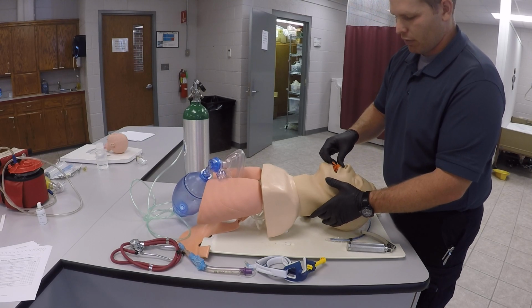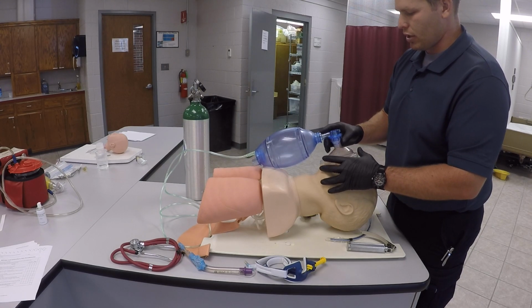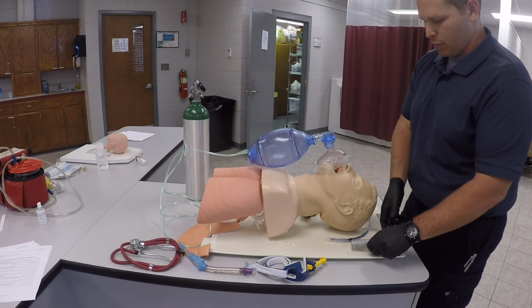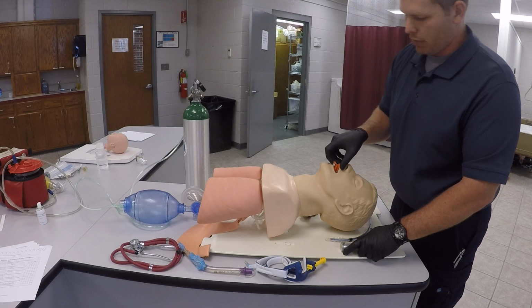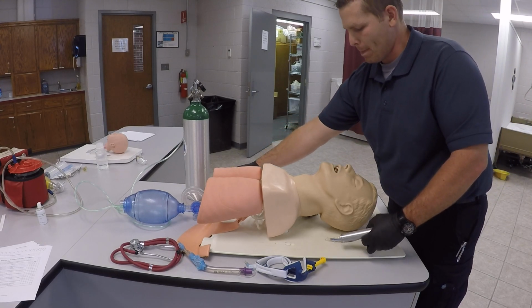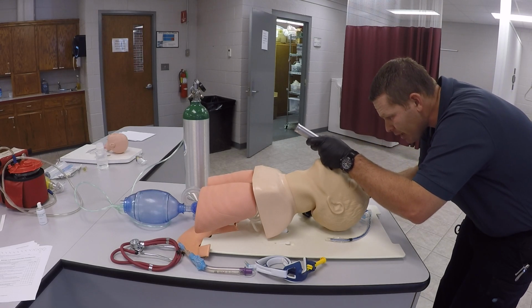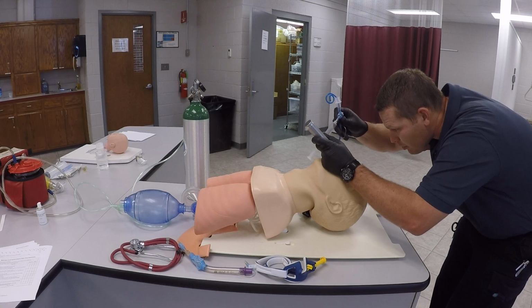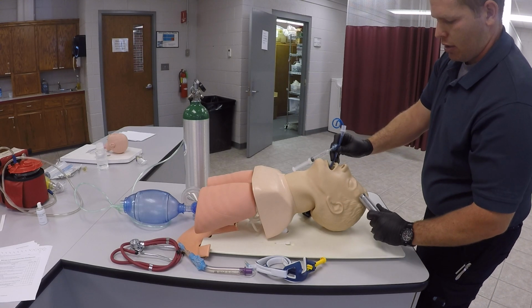Make sure there's no gag reflex there, and then we'll have our partner continue pre-oxygenating the patient and preparing for everything. Once he's pre-oxygenated, we're going to have him remove that, and we're going to have him remove the OPA. Go ahead and use our laryngoscope here and perform orotracheal intubation, inserting into the vallecula, taking our ET tube there and visualizing it passing through the glottic opening in the vocal cords.